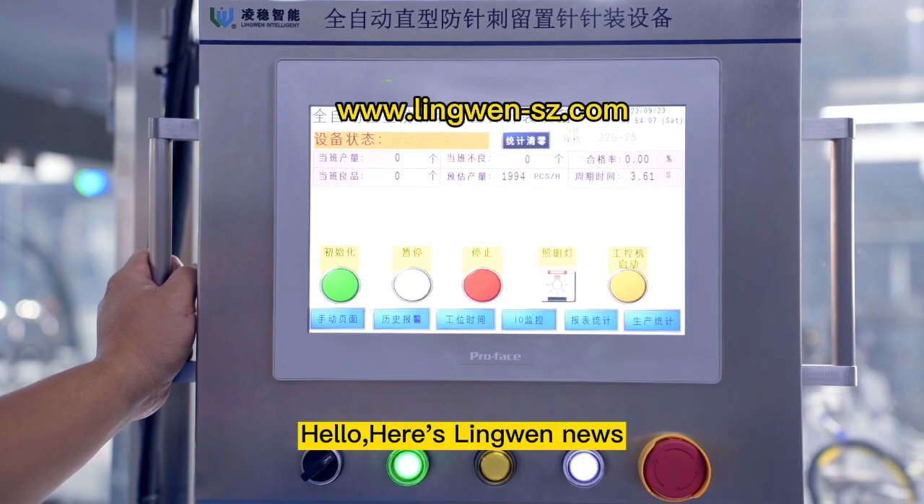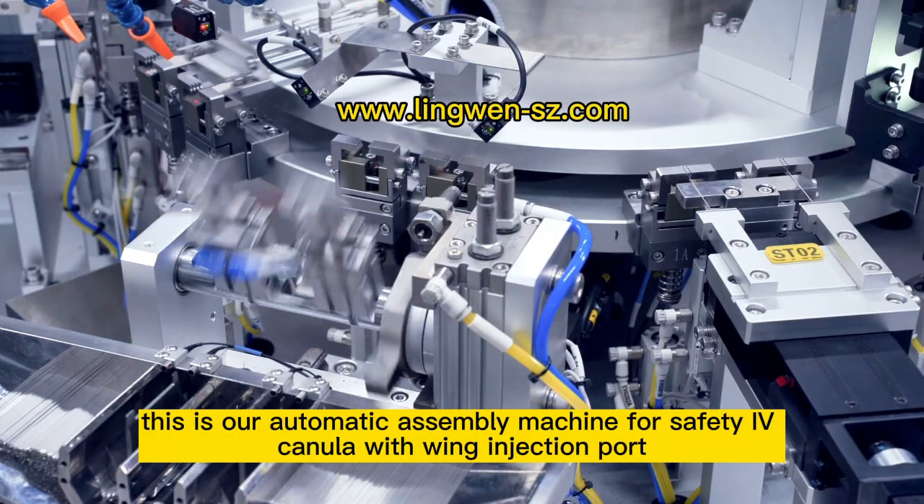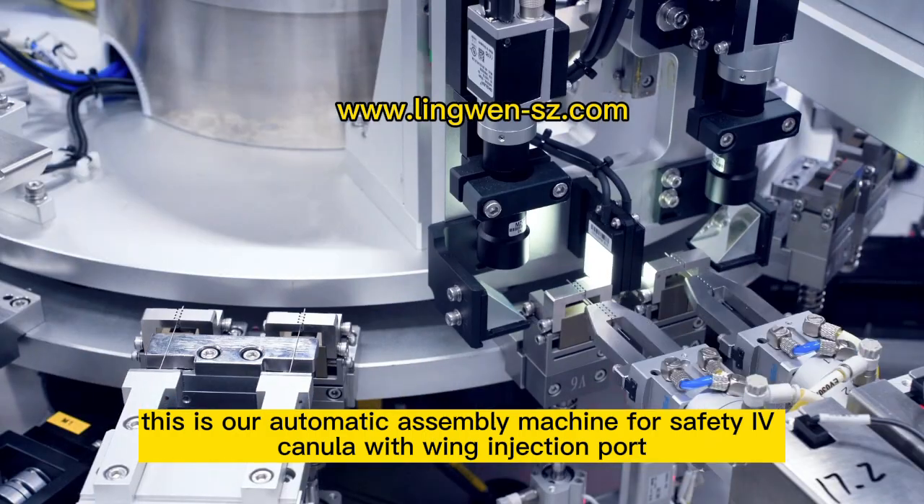Hello, here's Lingwen news. These are automatic assembly machines for safety IV cannula with wing with injection port.